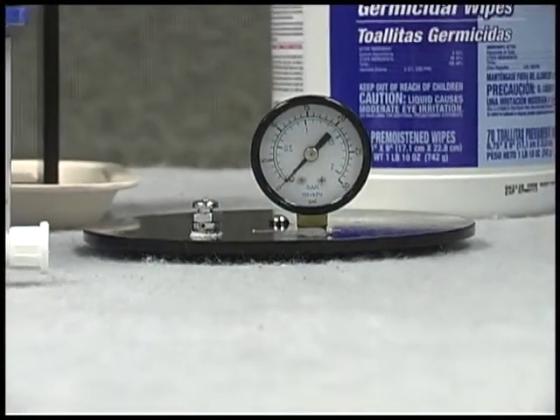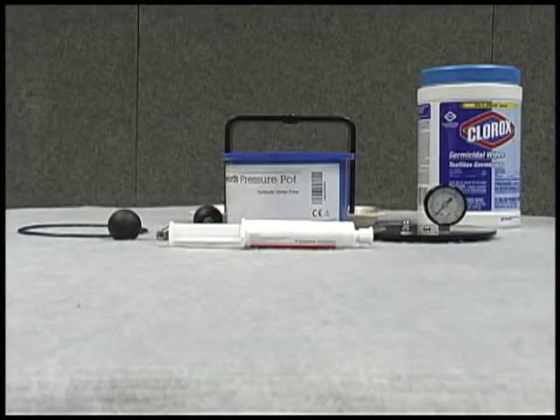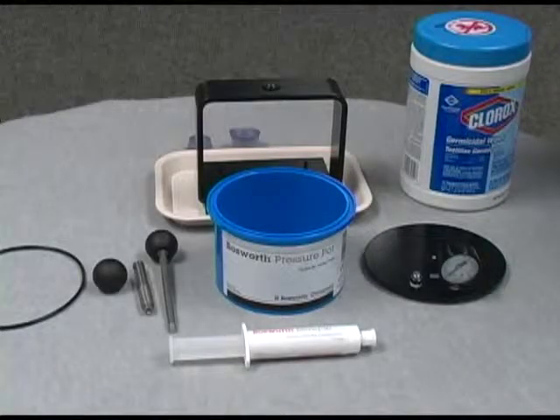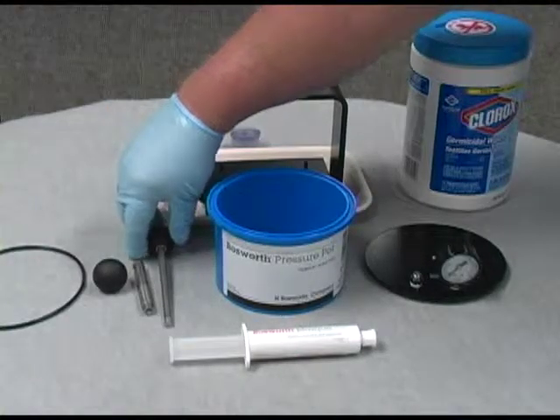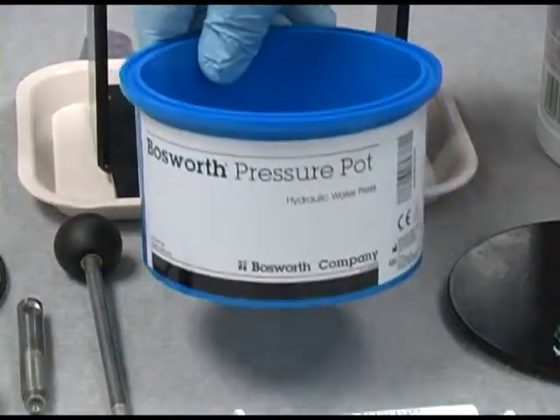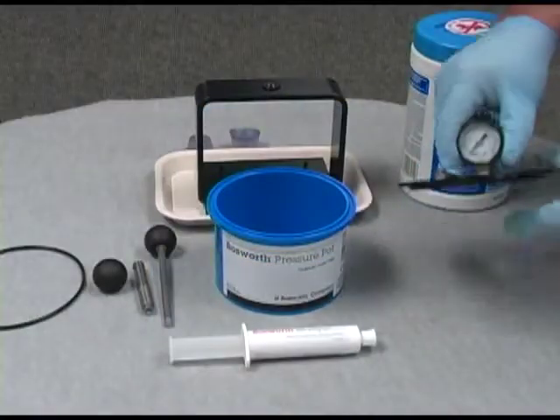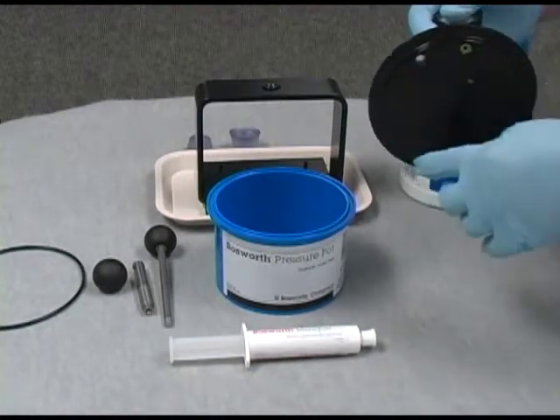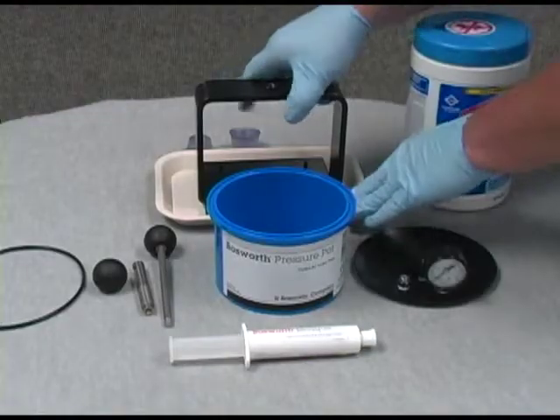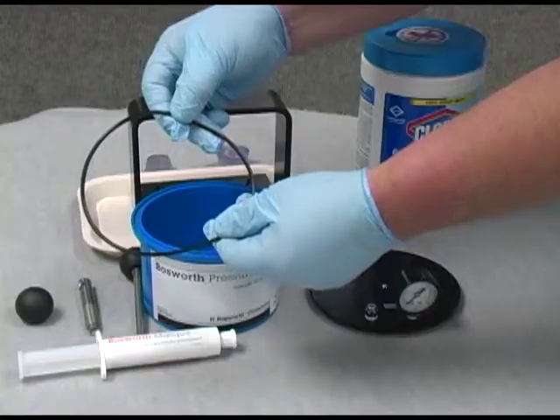It does not require electricity and it is easily portable from operatory to operatory. Your pressure pot includes a screw handle, a pot, a pot lid with a pressure gauge and a ballast feature, a frame, and an o-ring gasket.